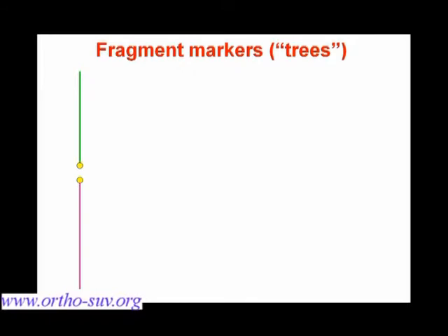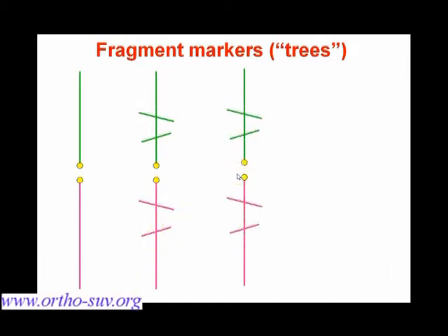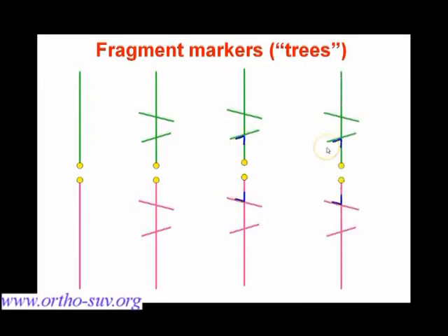Let us divide the trees into parts. Each tree has an axial line — you see the green line for the proximal fragment and the pink line for the distal. At their ends, they have yellow points marking the borders of the fragments. Each tree also has two horizontal lines, which can be placed oblique, and the second line, called the second centrator, has a blue angle.